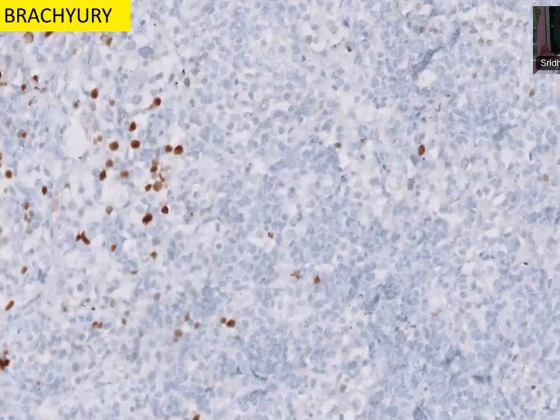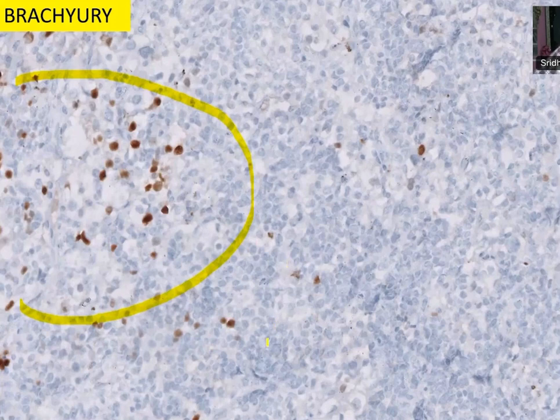You have a few cases that can get focal positive for brachyury. You should not jump to a conclusion. Brachyury is a nuclear marker for chordomas. Sometimes a poorly differentiated chordoma can show INI1 loss of expression. So when you have INI1 loss and a few cells brachyury positive, this should not be considered as poorly differentiated chordoma. You can get ATRTs with a few cells of brachyury.